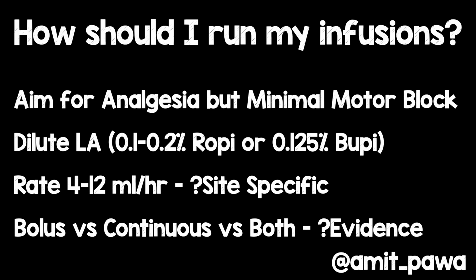But it could depend upon where the catheter is. Whether it's interscalene, you might need less volume than if it's a femoral or certainly a fascial plane block. And actually, bolus versus continuous versus both.